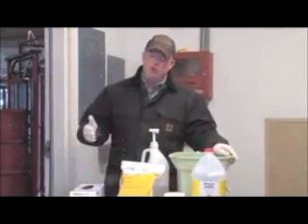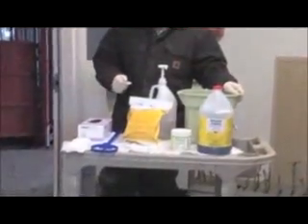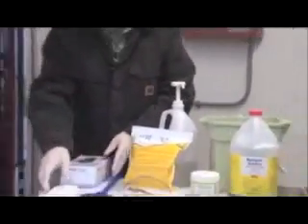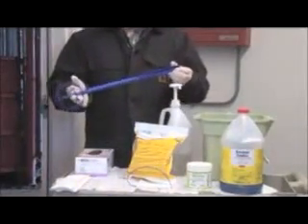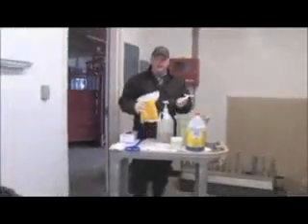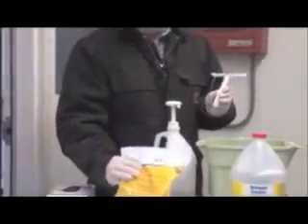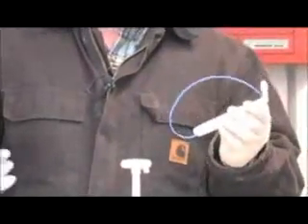For today's video series, we're going to go over proper CIDR insertion in beef cows or beef heifers. Laid out before you are the materials you'll need to properly insert a CIDR into a beef cow or a beef heifer. The CIDR is available through Pfizer Animal Health, and CIDR stands for Controlled Internal Drug Releasing Device. The CIDR contains 1.38 grams of progesterone and is inserted into the vagina, as I will demonstrate later, to release a constant source of progesterone to the cow.